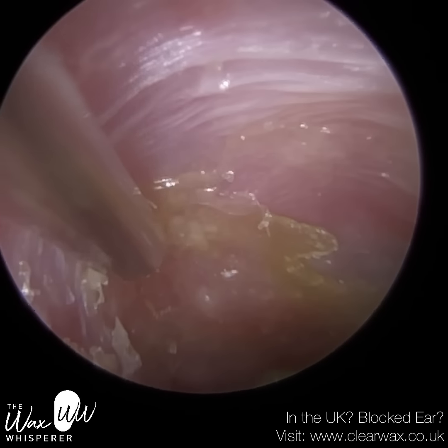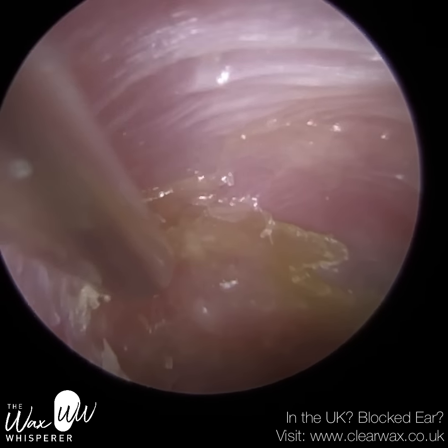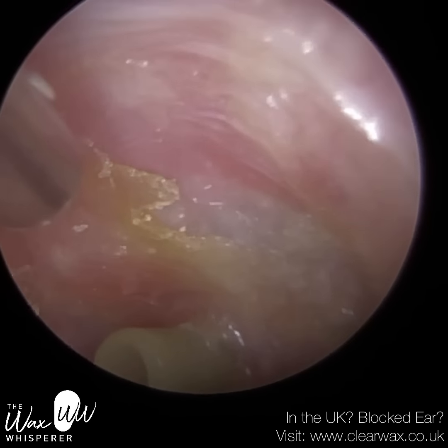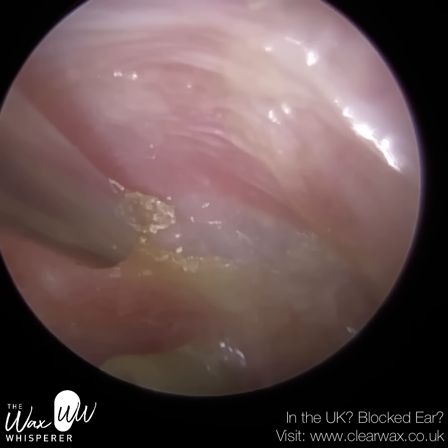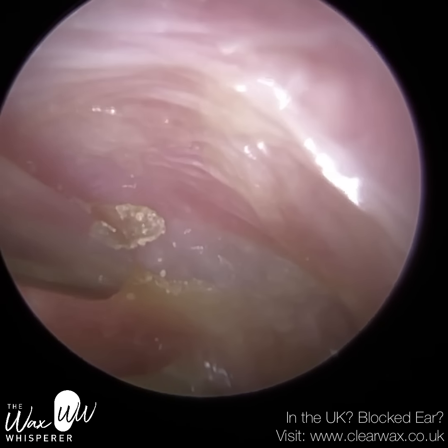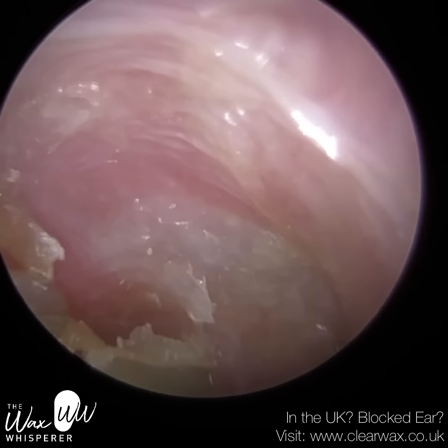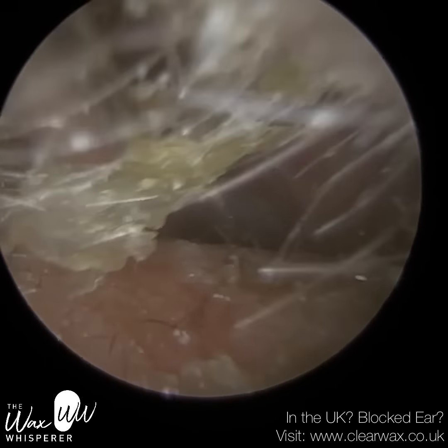Where was I? So I was talking about a grommet. One treatment of eustachian tube dysfunction, so when you've got a vacuum effect behind the eardrum, is for an ENT doctor and surgeon to insert a ventilation tube, and they're called grommets. So the surgeon, using a scalpel, makes an incision into the eardrum, and so in essence, they're artificially perforating your eardrum by doing that. Sometimes there's some catarrh and fluid behind the eardrum as well that they suction out, and that's because that fluid can't drain out of the eustachian tube because it's blocked.